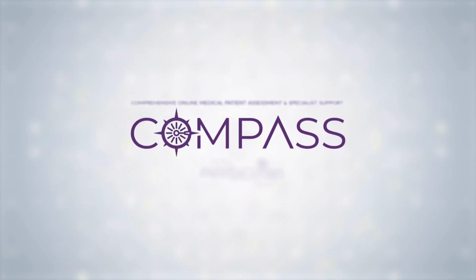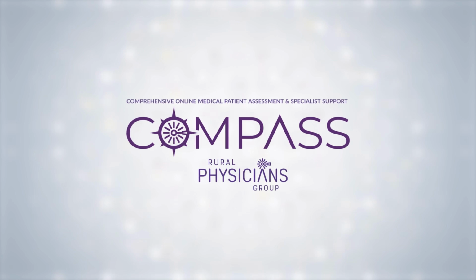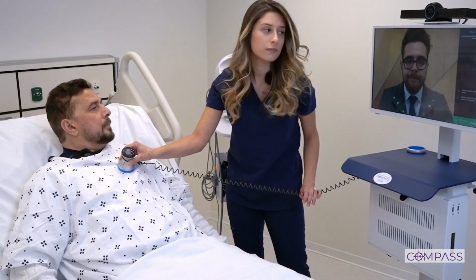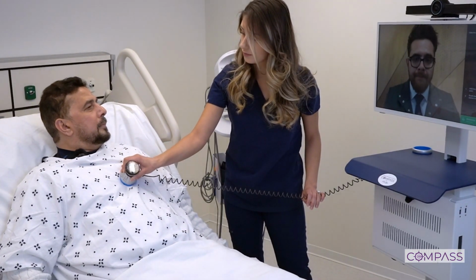Welcome to Compass, the comprehensive online medical patient assessment and specialist support program by Rural Physicians Group. This video will demonstrate the basics on how to use the Compass virtual healthcare device to successfully administer remote provider consultation. So let's get started.